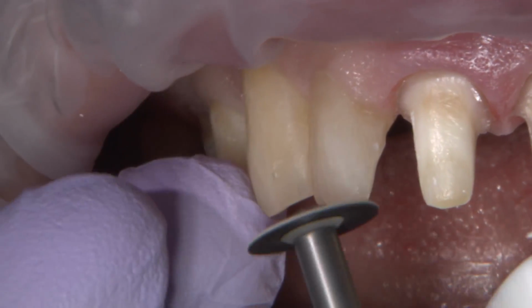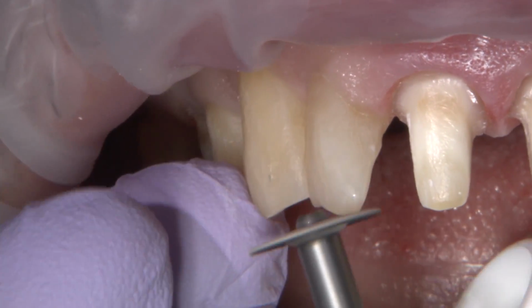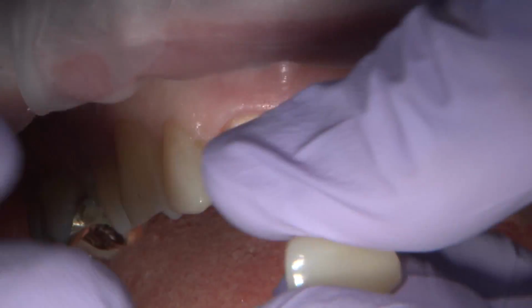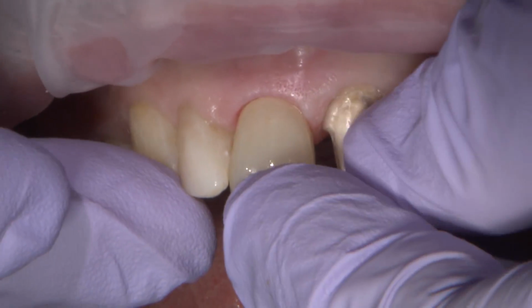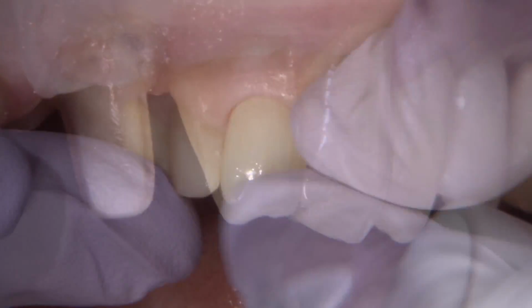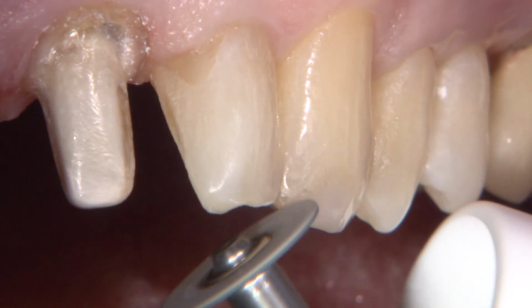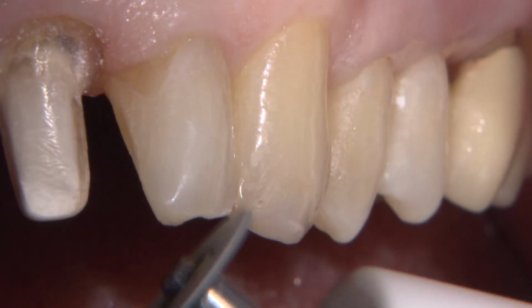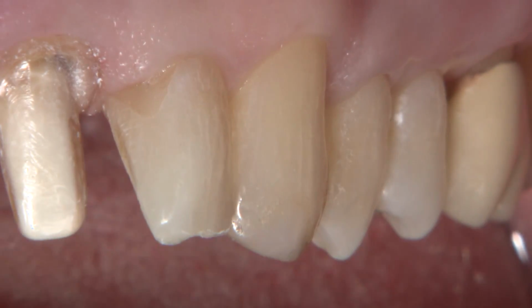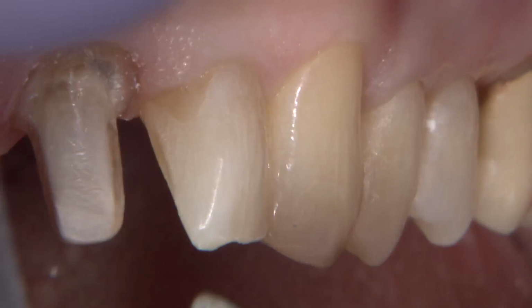Once it's cured, I'll smooth and polish the surface with the soft flex discs. And now with number 8 back into position, we were able to successfully close the diastema that was present. When trying in 8 and 9, I continue making some minor adjustments along the laterals with the different soft flex discs until they flow well with the new crowns.